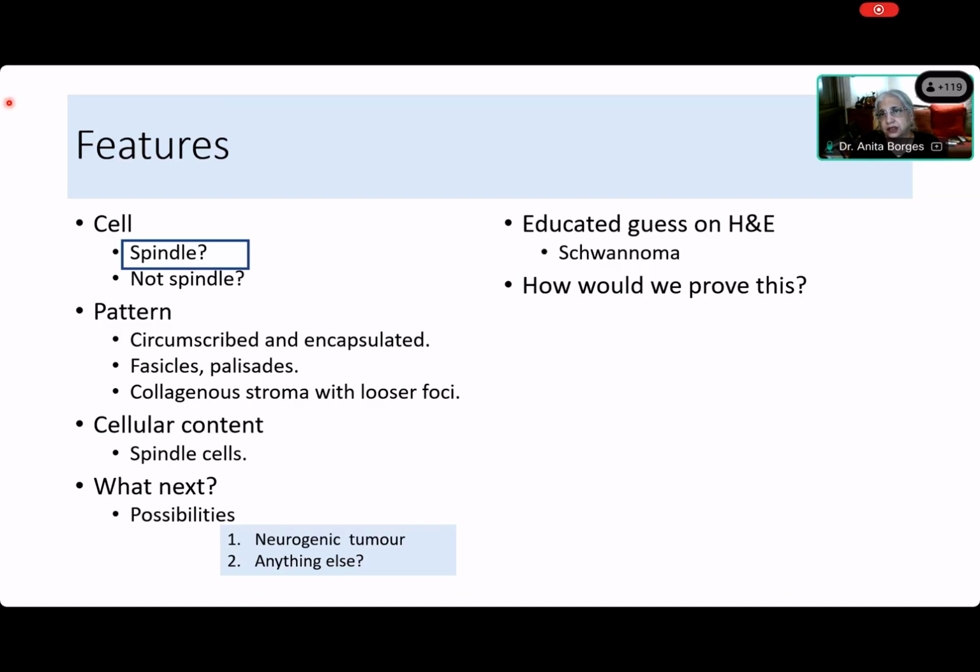So how will we prove that this is a schwannoma? Saida? We're doing S100 IHC. Oh, we don't do IHC in this. How will S100 tell you it's a schwannoma? Come on, Saida. How will S100 protein or SOX10 tell you that it is a schwannoma? Can it be a neurofibroma? If S100 and SOX10 are positive, can it be a neurofibroma? Yes or no? Yes, ma'am. So we just saw a neurofibroma that was S100 and SOX10 positive. So what's the reason for doing S100 and SOX10?